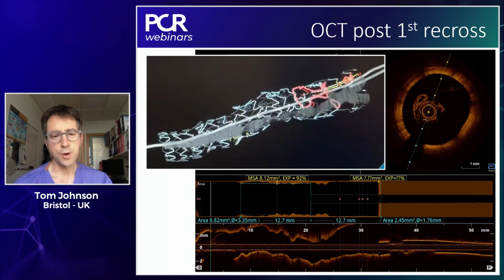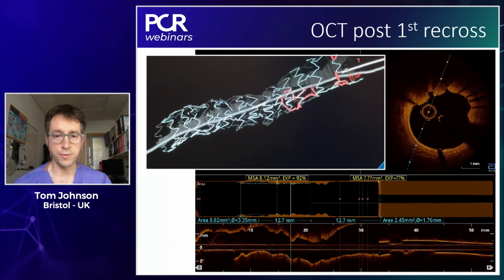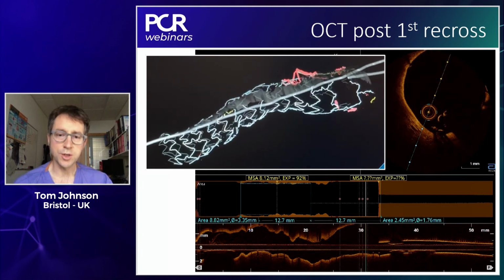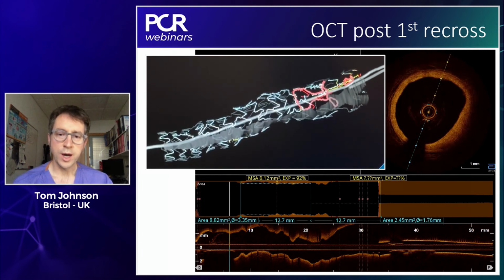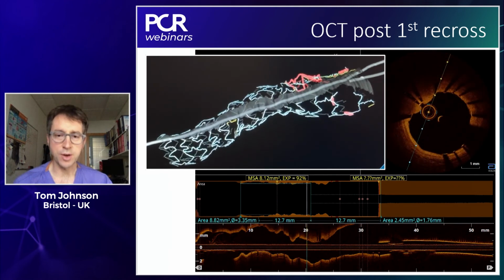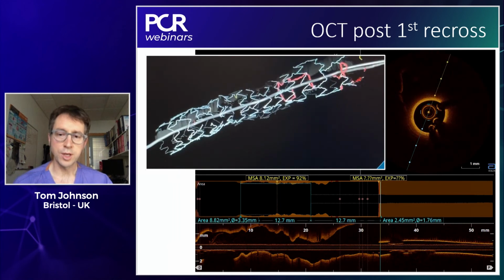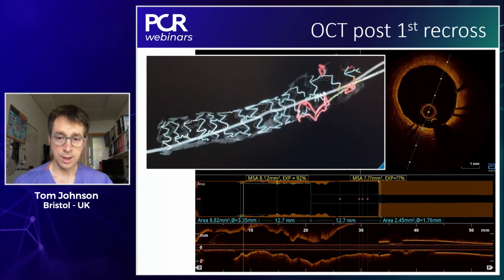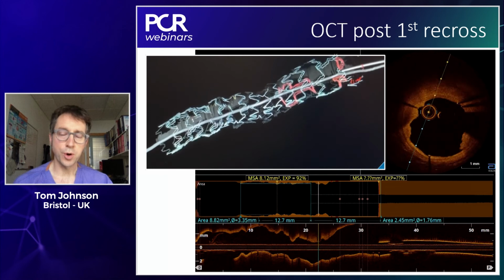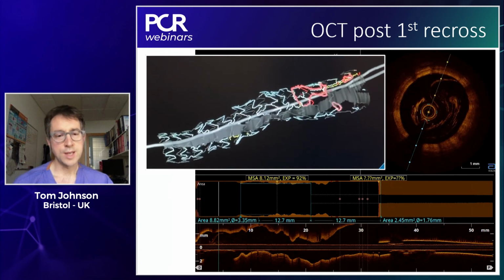So going into the fly-through navigation mode and then just taking out the vessel wall, we see again these beautiful three-dimensional reconstructions. And actually the wire appears to cross very, very proximally. It's not very well visualized. It's actually buried under the other wire, the LAD wire. But my concern here, certainly looking through the still frames, the cross-sectional imaging of the OCT, is that this wire has crossed very proximal. And if we pursued a KISS, we might leave stent struts across the ostium.